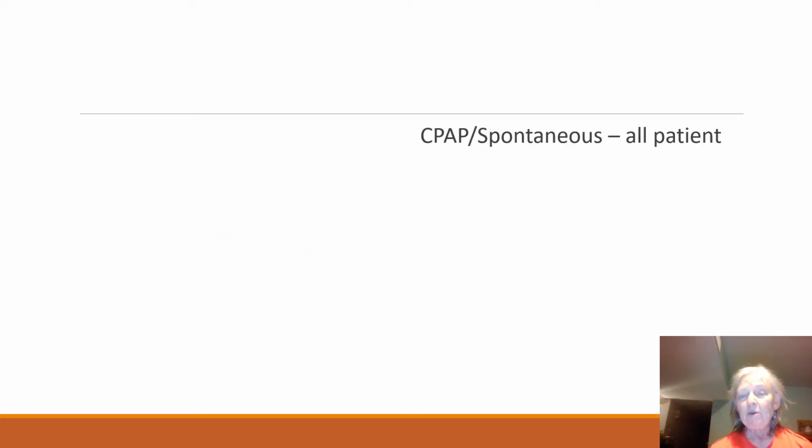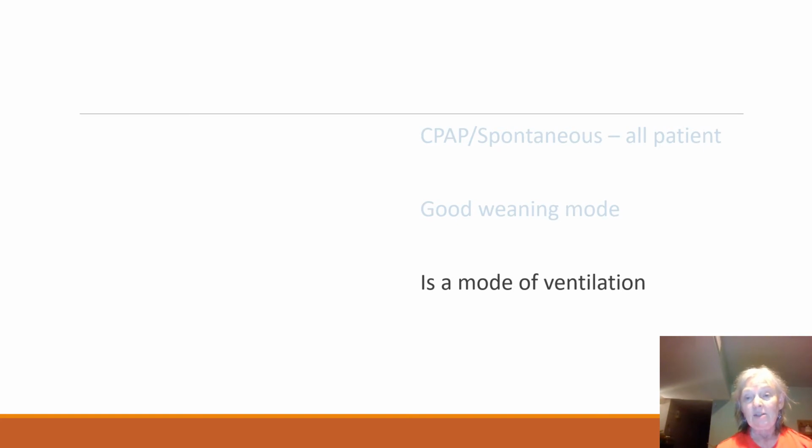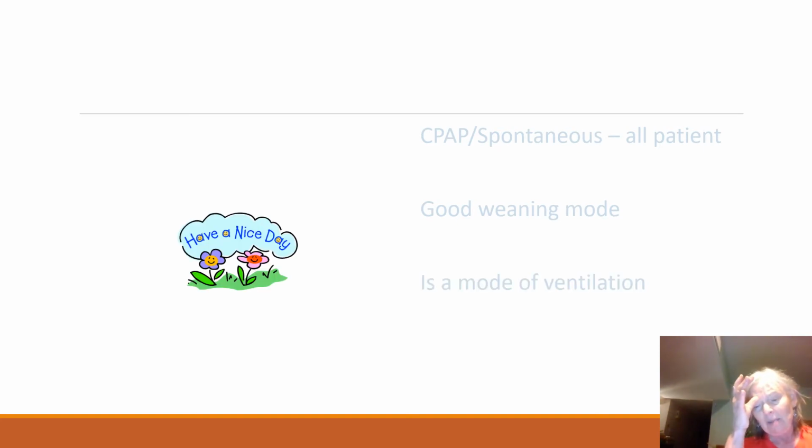So CPAP, for the most part, or spontaneous, it's all patient. It's a very good weaning mode, and it is a mode of ventilation. Some people tell you it's not, but in fact it is.